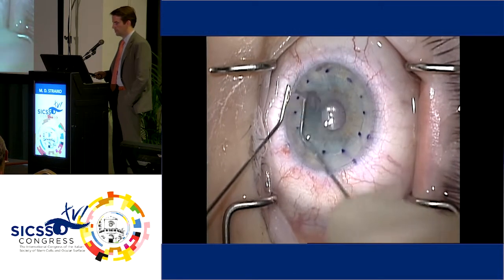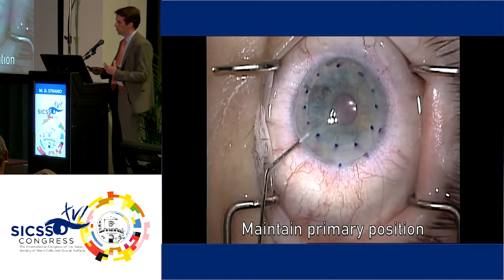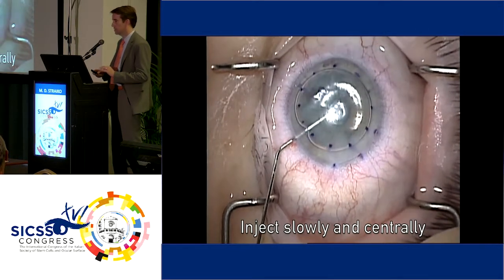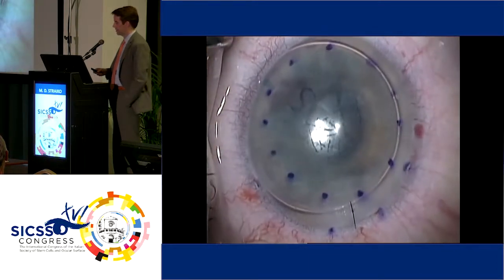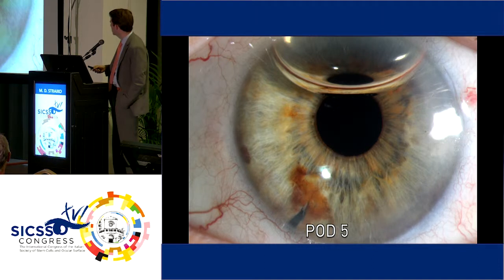And after that's centered, then we'll lock it in with a gas bubble. And so maintaining the eye in primary position is very important. If you tort the eye up or down, it can decenter the graft when you inject, and you want to inject very centrally, right in the middle of the graft to lock it in. And you can see as I zoom in, little areas of endothelial cell damage, but not bad. Overall, it looks very healthy. Post-op day 5, this was my first preloaded case, and the graft was excellently clear, and her vision was already really recovering quickly.